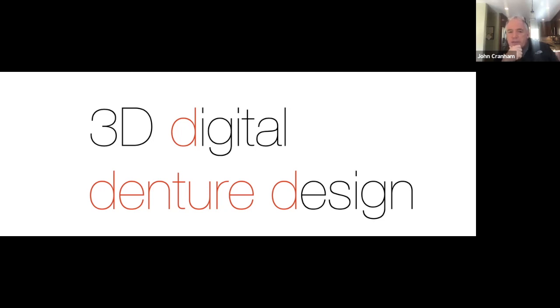The last question for me is that Ivoclar Connect. If we were to use that on a PMMA, say provisional, whether it's on implants or teeth, could you reline with a traditional acrylic? Would that help that bond or not necessarily? Different chemistry. And we haven't really seen any problems on teeth because a lot of people reline shells with bis-GMA. Nobody's reported to me that they're falling apart in the mouth. So it kind of goes in the reverse.